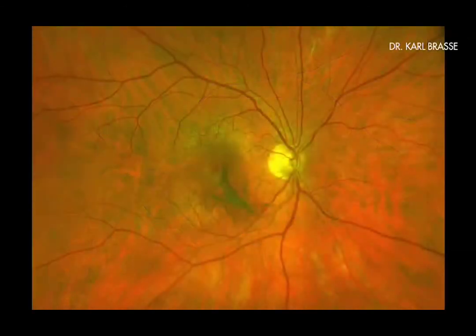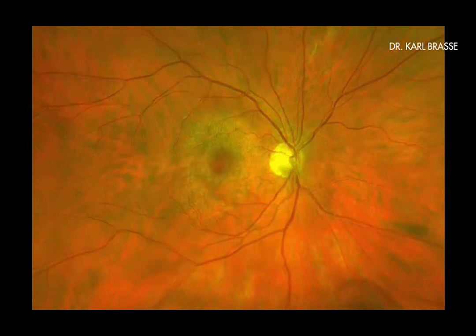This is a similar case, luckily less pronounced. The patient was quite young and decided to have a laser treatment done. But again, I recommend not to perform it in one session, and please be prepared that the patient might get high ocular pressure rises. Luckily, a good result without complications could be achieved, as you can see.